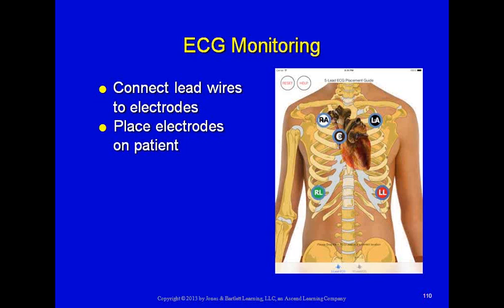When we're connecting the patient up to a heart monitor, most heart monitors these days use 4 or 5 leads. There's a few out there that have 3 leads. The 5-lead models have a white electrode which goes above the second intercostal space but below the clavicle, and then a black electrode which goes in the exact same spot on the left side of the patient.